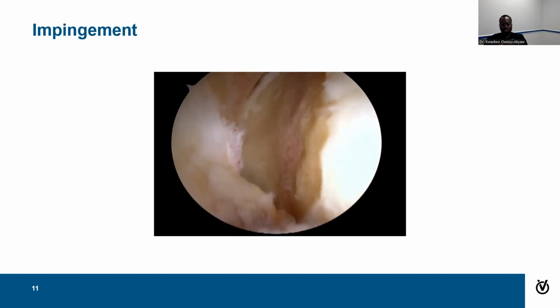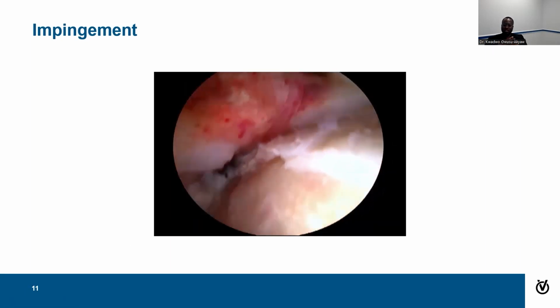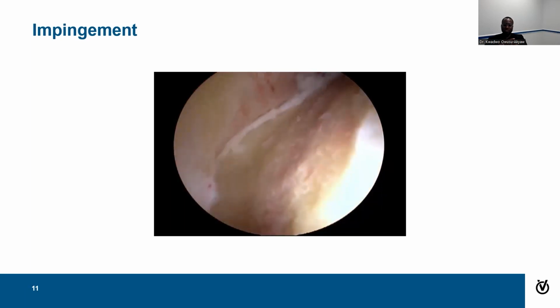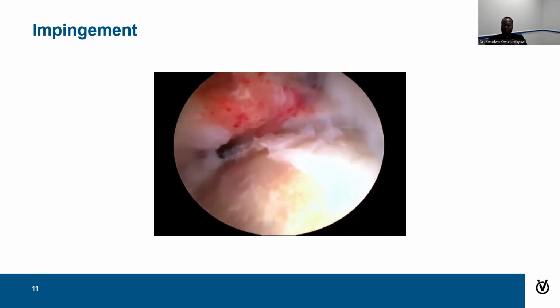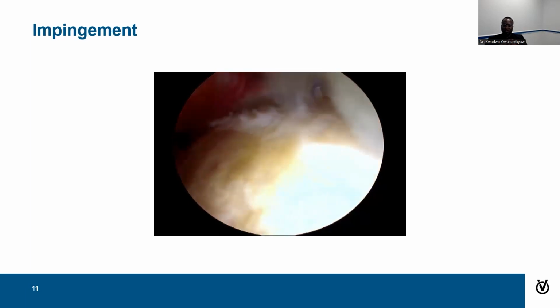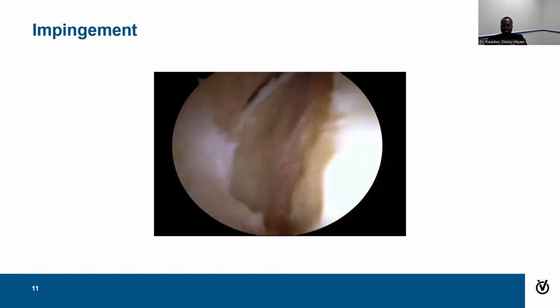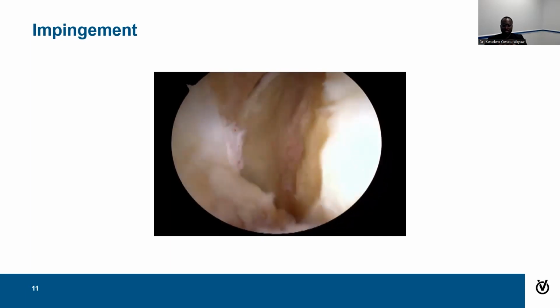We can watch it one more time. So once again, we're looking at the spot where we smooth out the bone. We're looking at how the hip moves nice and smoothly. The labrum's not being impinged, it's not being injured when we move the hip up in flexion. And as we move it around, you see that you have a nice suction cup seal on the hip joint. It's staying in place, and it's exactly what we want to see at the end.